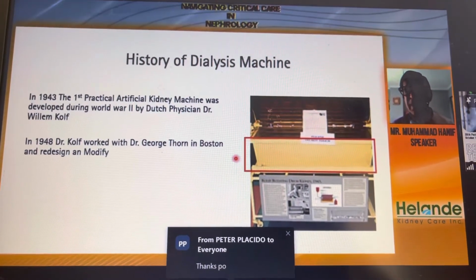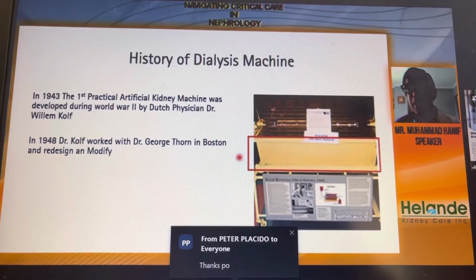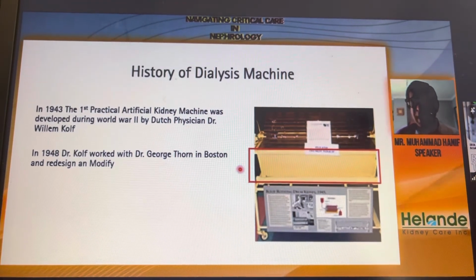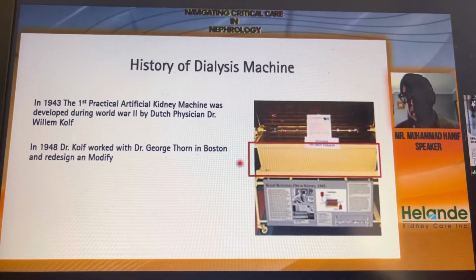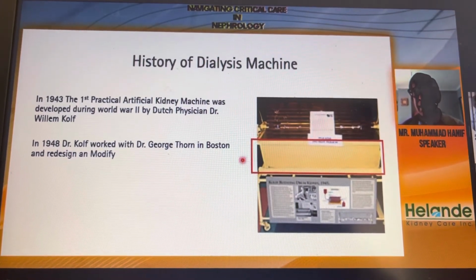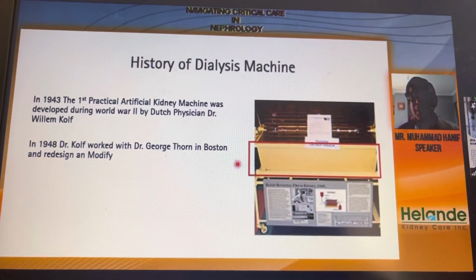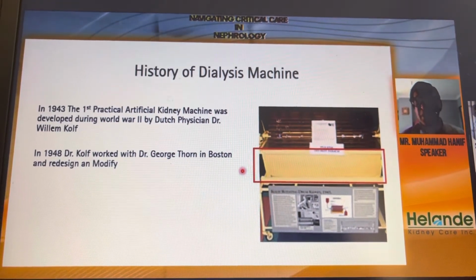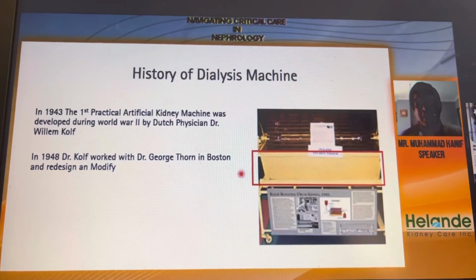The bathtub basically holds 150 liters of fluid, and one treatment, today and in the past, required 150 liters of dialysis solution. So that's why we prepared it in the bathtub, and they called it the dialysis bath. Today, many prescriptions still say dialysis bath, not dialysis solution, because in the books it's written dialysis bath.